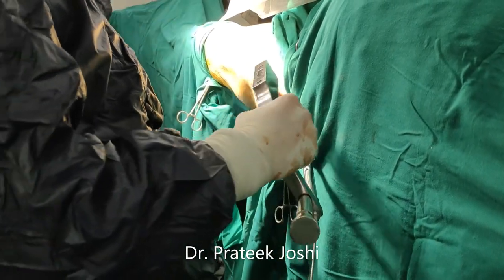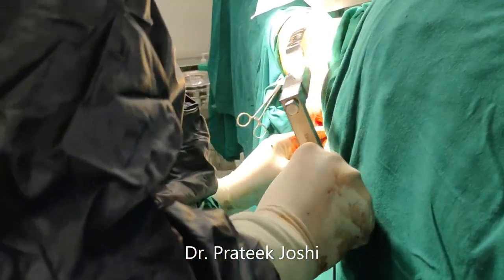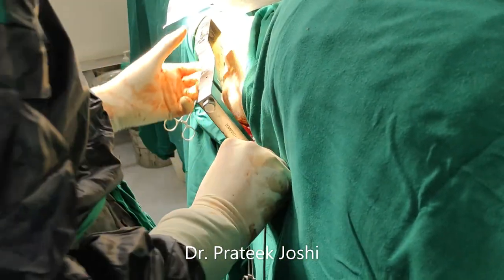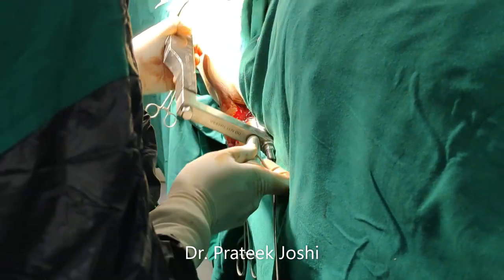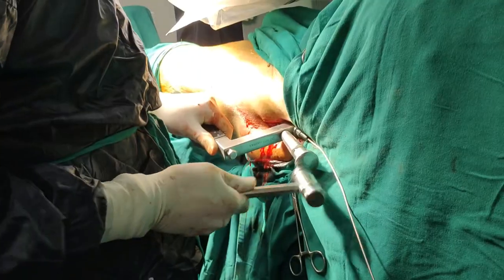Now we choose appropriate diameter short proximal femur nail based on patient's femoral canal, which can be assessed on the IITV. We mount the nail on the jig and advance it on the guide wire.